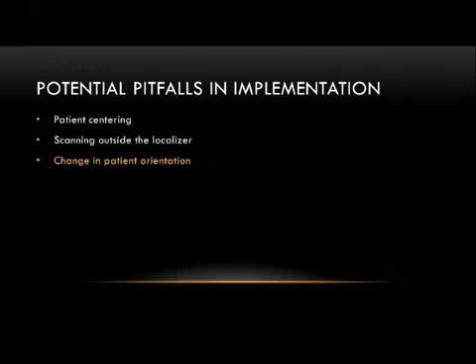So that's a significant pitfall, and again, I think a lot of the vendors deal with it differently, and it's something to be very important and aware of. And maybe make sure, especially if you're going to scan well outside where the original localizer was, to acquire another Scout and plan off of that so that the tube current modulation can act as it's needed to, and that you get the right image quality for the imaging task.